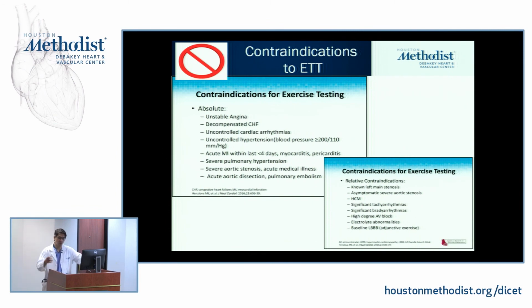And then there's a whole host of relative contraindications, and I know everybody in this audience here today has stressed many of these patients. But really the hard contraindications are those who, when you look at them, they don't look right, they're already not feeling well.